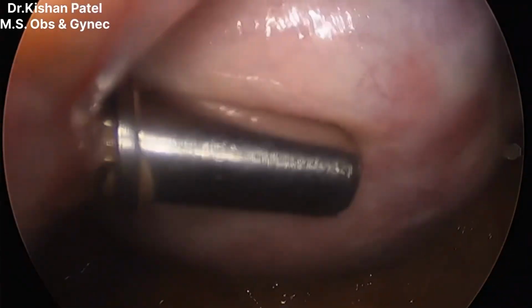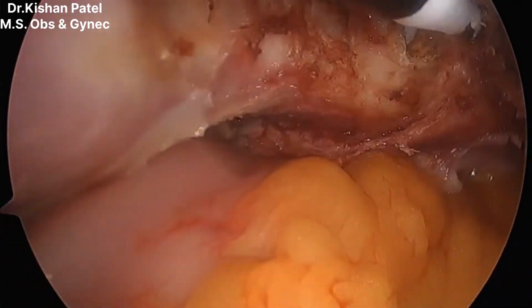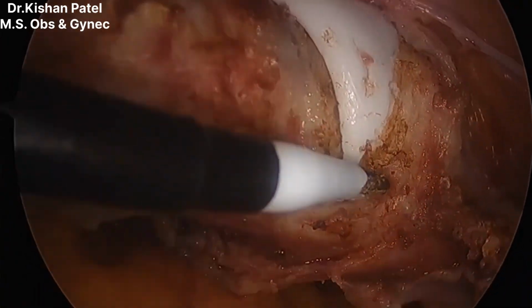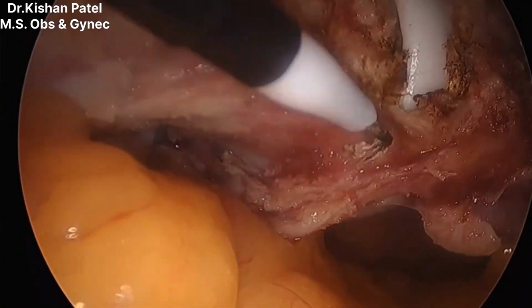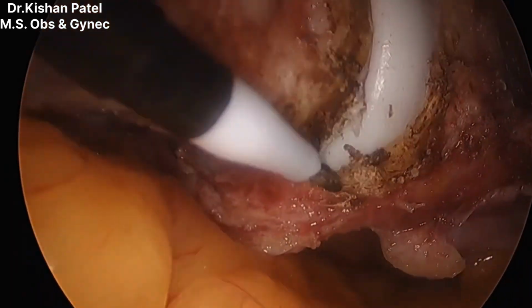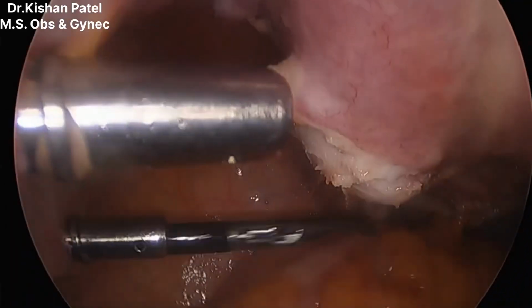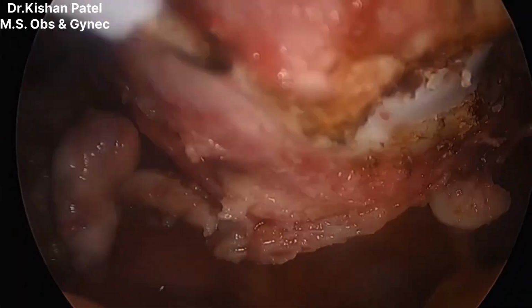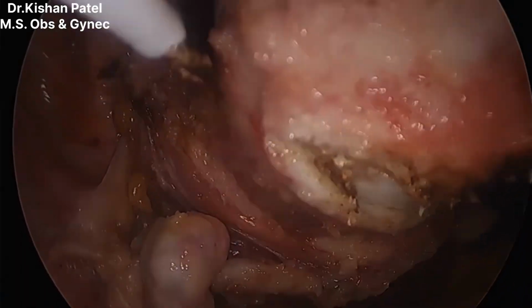Again we will come from behind the uterus. We are protecting the bowel with another instrument. As you can see, we have reached posteriorly the uterosacral ligament. Now we are completing the ring around the vaginal manipulator.